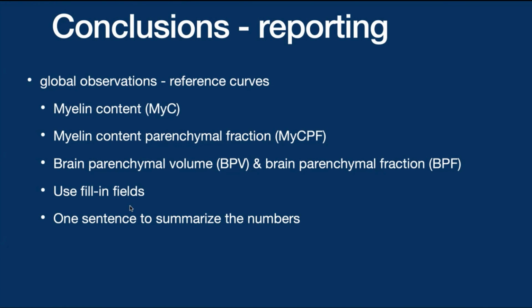Using fill-in fields facilitates reporting. I recommend adding a single sentence following the tabulated metrics to highlight the key observations. The last thing referring clinicians want is a sea of numbers they have to slog through. Always try to make it easier for them. With that, the formal presentation is concluded.